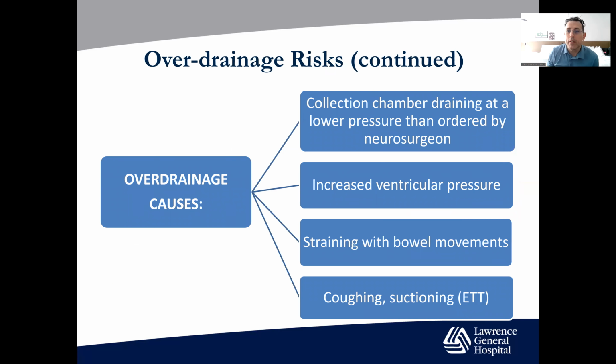Now, over drainage risks. Over drainage is something that we will discuss in more detail when I talk about leveling the EVD and how the EVD actually works towards drainage of CSF. But keep in mind here that you can have over drainage if the collection chamber is draining at a lower pressure than what was ordered by the neurosurgeon. This will be clearer in later slides.